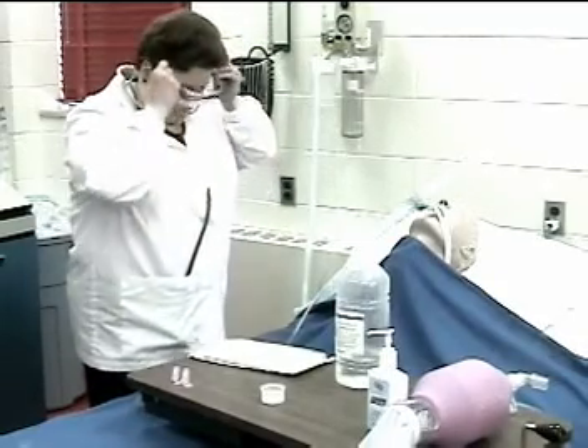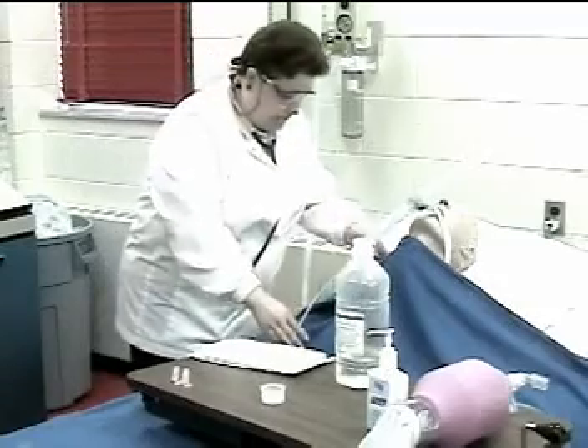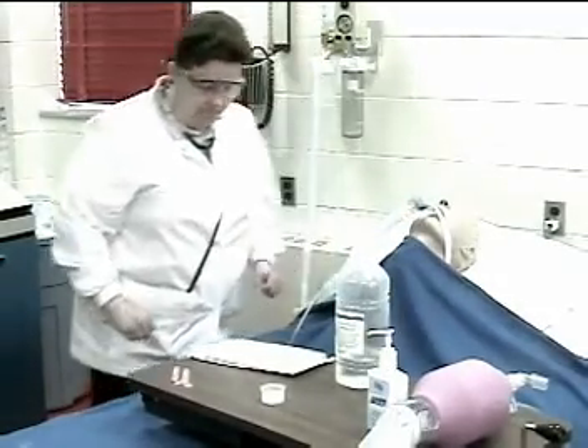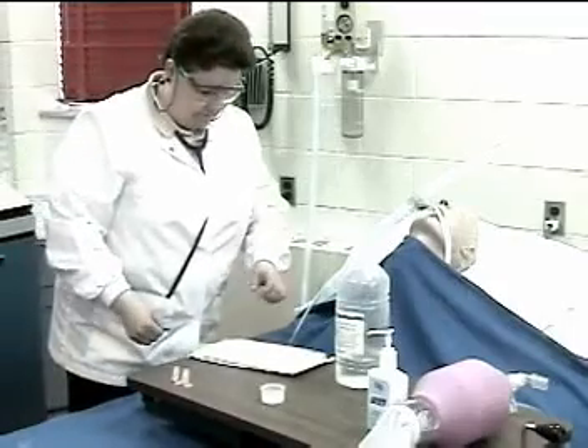Positions the patient as indicated. Are you comfortable? Good. The need for suctioning has just been assessed.